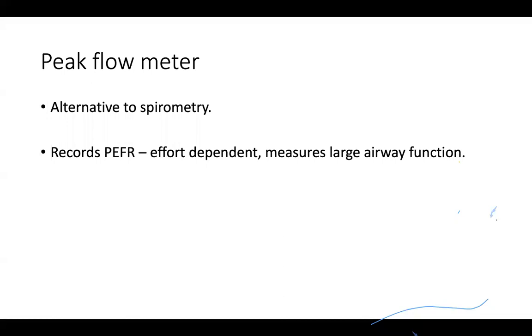These peak expiratory flow rate meters are usually dependent on the height of the patient. So you look at the height and determine the expected PEFR, and then you can tell them how to do it. You have to take the three best readings every day and see how they go. Ideally, you should prepare a diary, so that you can tell them the different symptoms they can feel, and when they come to you for follow-up, you can look at it and adjust your dosage.